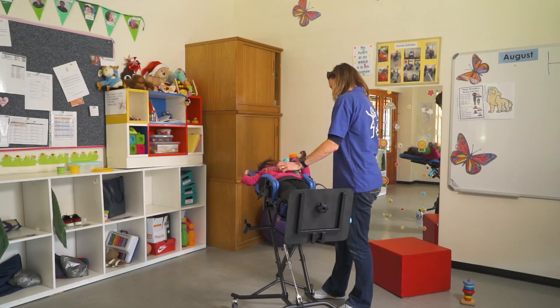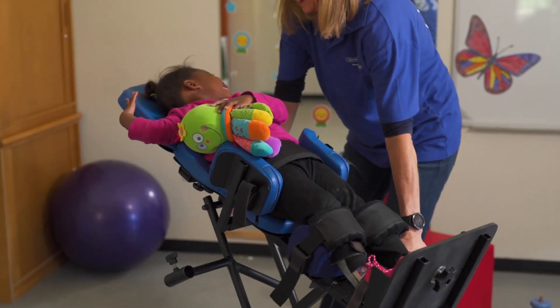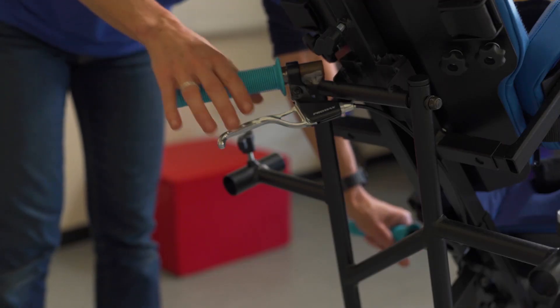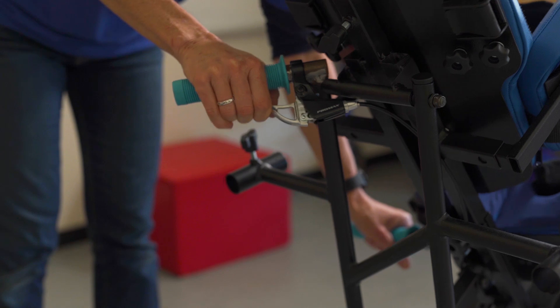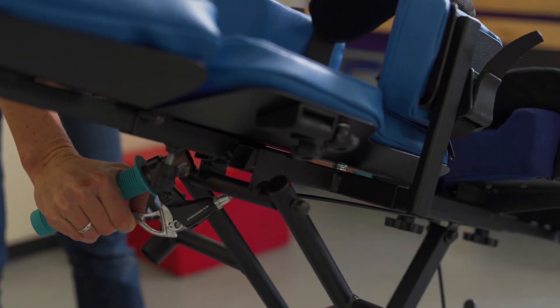Tilting. Tilting the Stand to Go is as simple as pulling the brake lever on a bicycle. To raise or lower the tilt angle, place a hand on each hand grip. Pull the brake lever to release the actuator. Tilt the user to the desired angle and release the brake lever to lock.